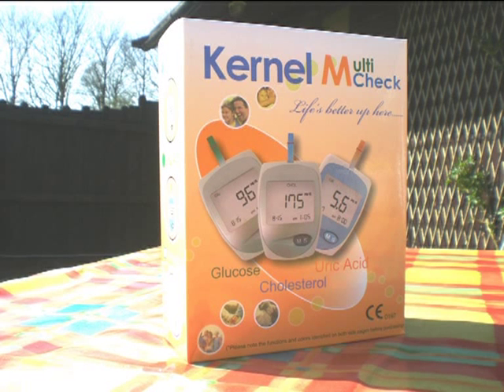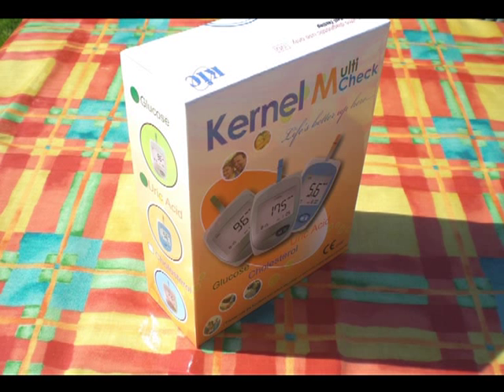This video guide gives you an easy step-by-step instructional guide on how to use your Kernel multi-check meter.